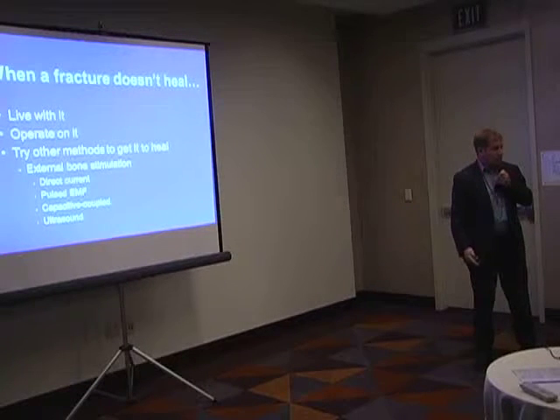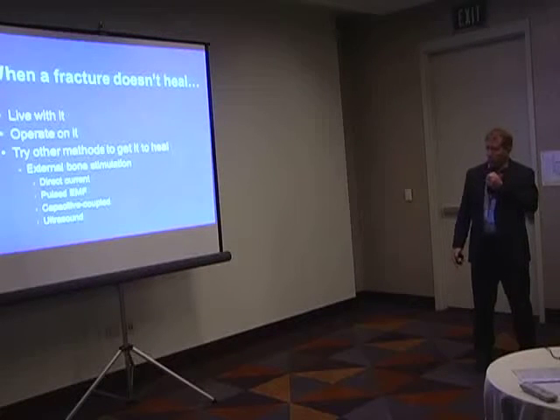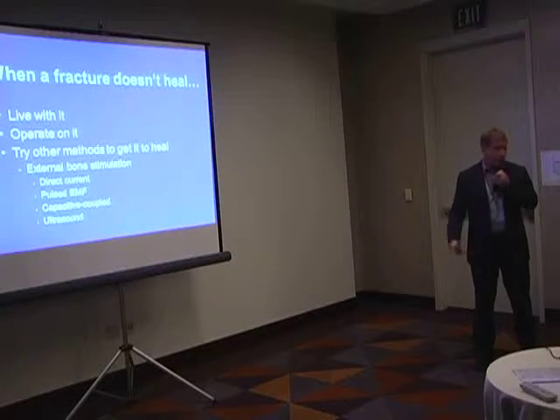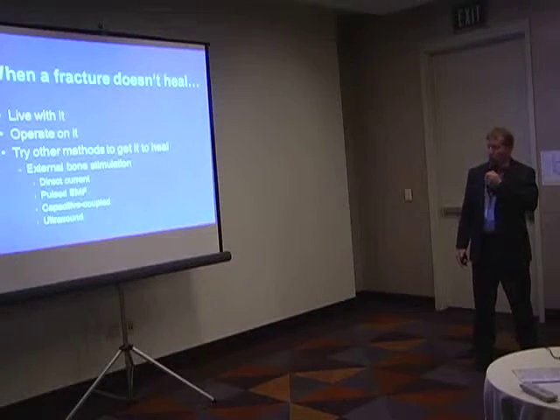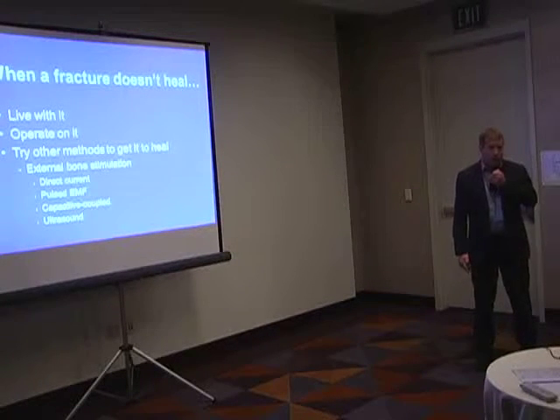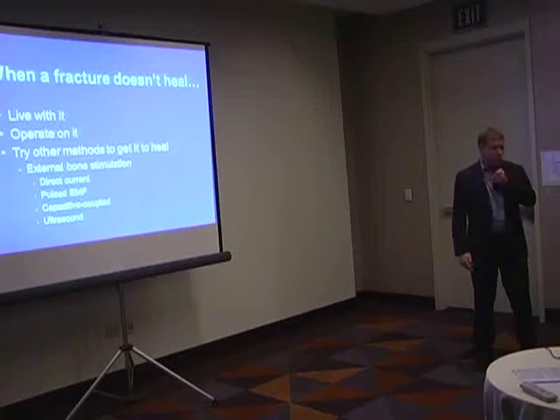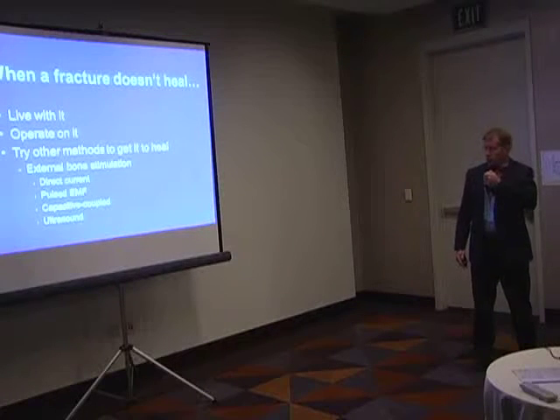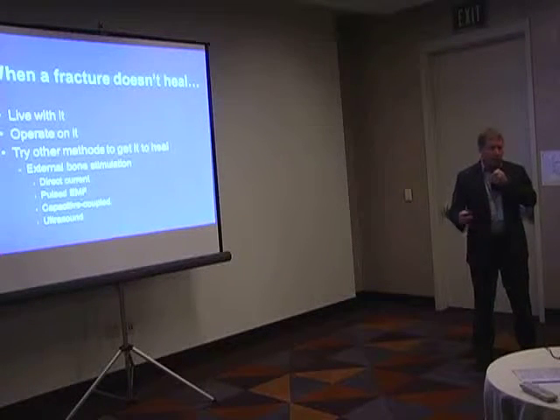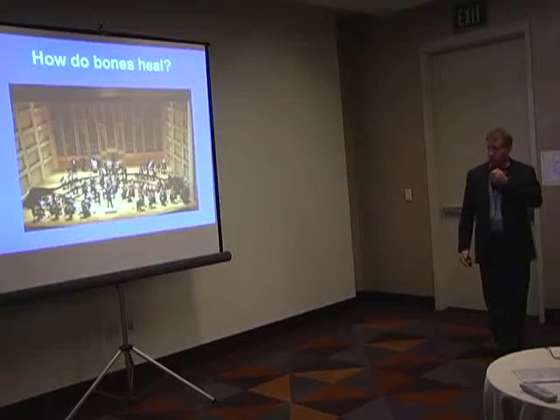And there are different ways in which an electric field can be placed around the bone. There's direct implantation of electrodes, direct current devices. There are fields that can be induced by electromagnetic or pulsed electromagnetic fields, which is one of the devices you see here. You can also place two electrodes superficially and, through capacitive coupling, generate an electric field. And then again, ultrasound is another form of bone stimulation.